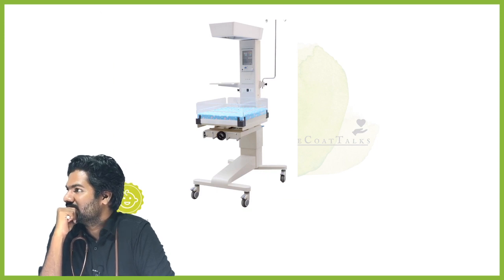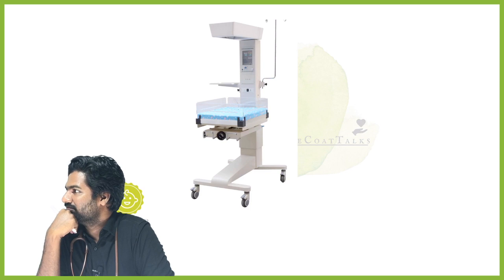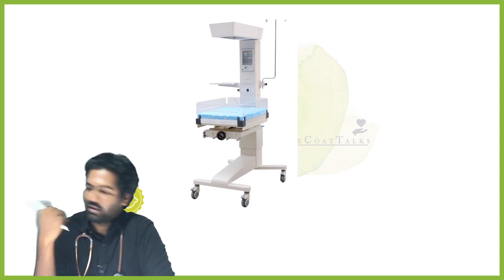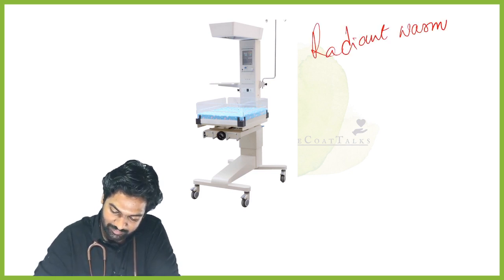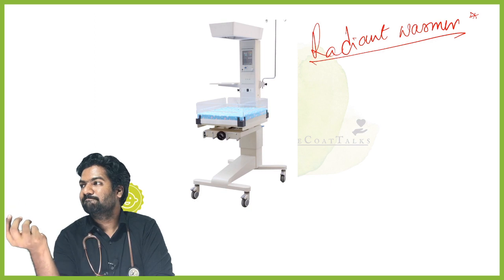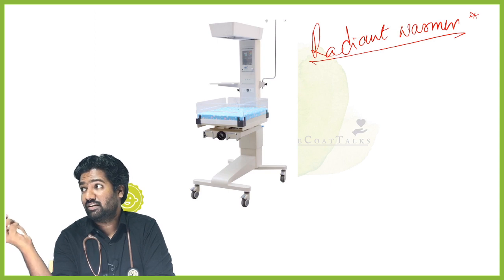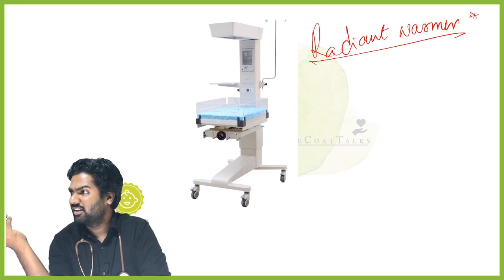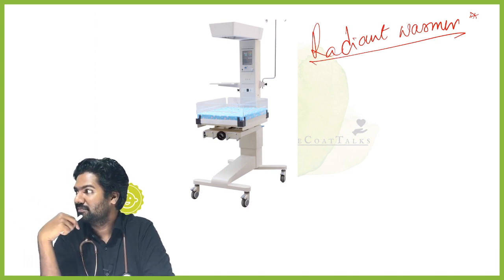Convection. Almost all of them have answered. The incubator, the radiant warmer. Okay, definitely yes, this is a radiant warmer. Most of you have answered it correctly. Now, any answers where they have mentioned how it is different from an incubator? Mechanism of heat generation is radiation, okay, that is smart. The mechanism of generation is radiation in the warmer.